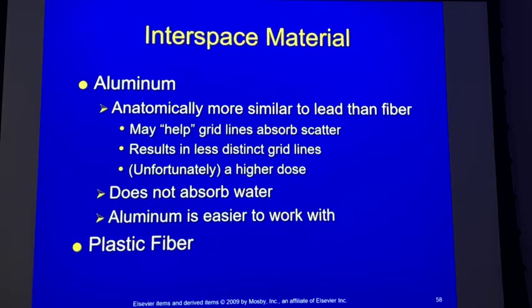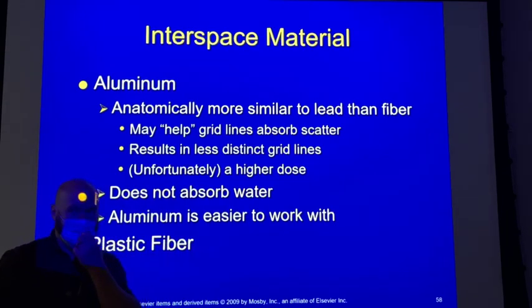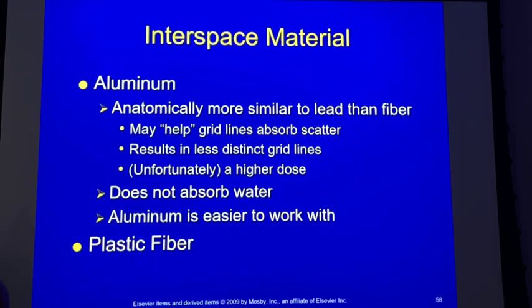So paper, or any kind of interspace material that absorbs water, is really preferred not to be your interspace material. Aluminum, though, is what a lot of grids are made with. Now, is aluminum radiopaque?